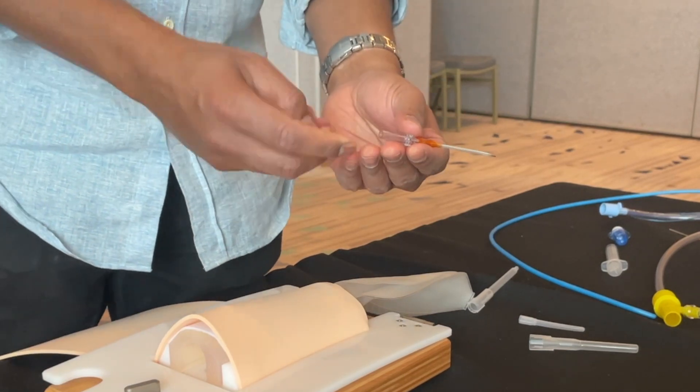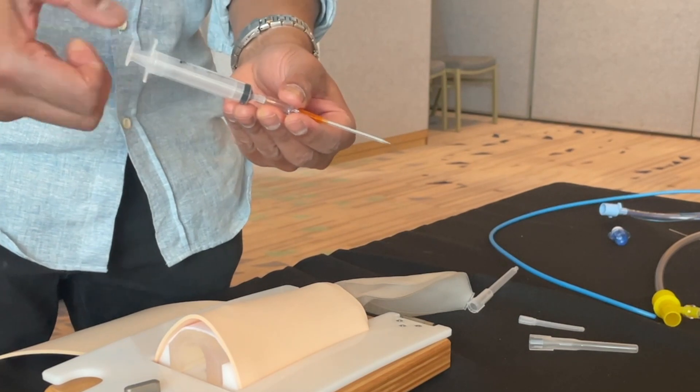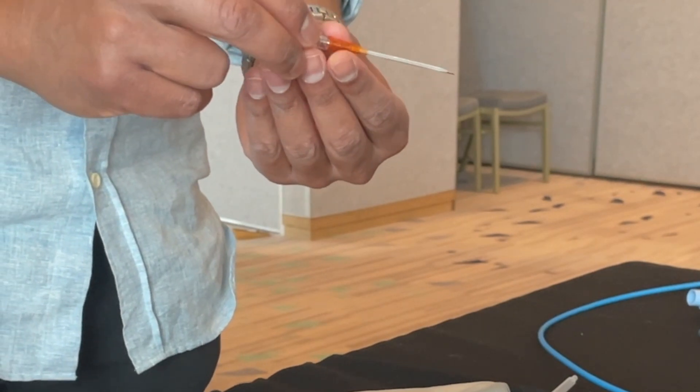The BD inside cannula is really useful because first of all, you can take the back of the chamber off — that's where you can attach a syringe and check for positive aspiration of air. Also, this cannula isn't a safety cannula, so you can reinsert the needle.